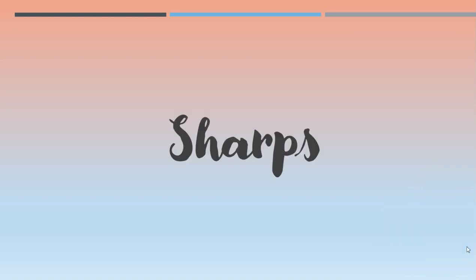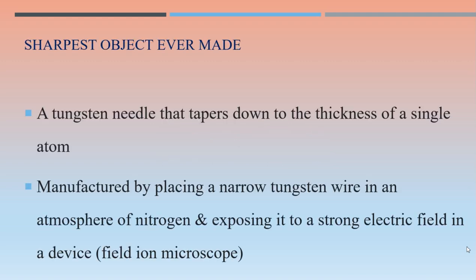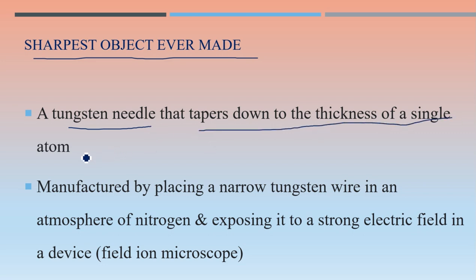So first of all, sharps. Under sharps, the first component is needles, the various surgical needles used with the suture material. One of the important pieces of information: what is the sharpest object ever made till date? That is the tungsten needle. It tapers down to the thickness of a single atom.